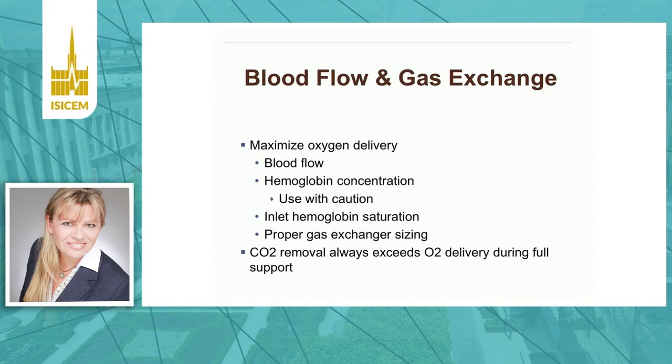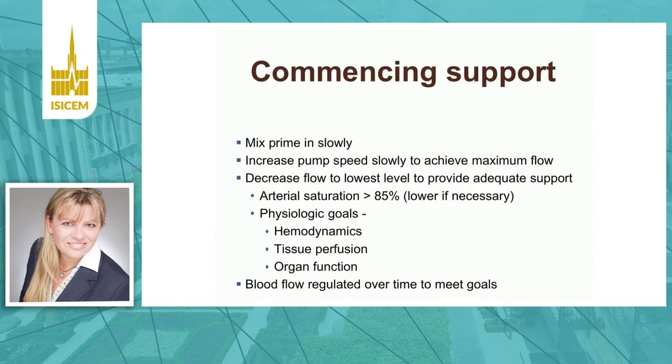So this is how we can maximize oxygen delivery, and these are the components which influence this. Commencing support is to increase the pump speed slowly to achieve a maximum flow, and then decrease flow to the lowest level that provides adequate support.